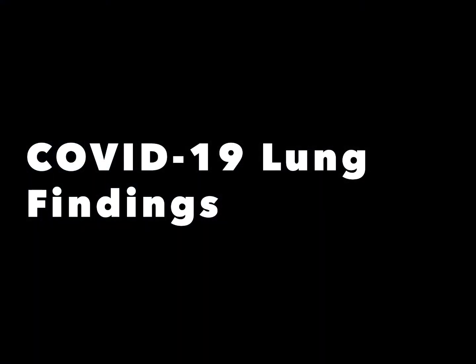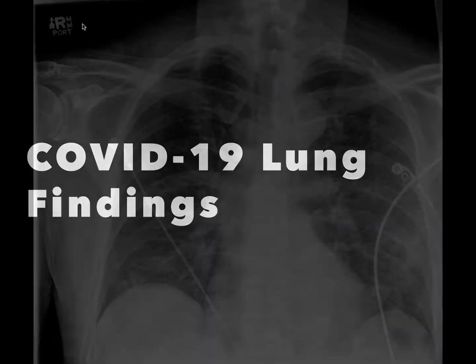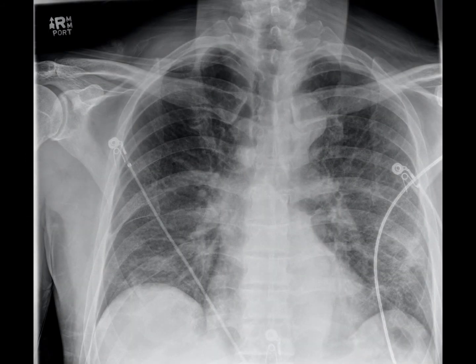Let's move on to our second objective, lung ultrasound findings in COVID. Here are chest x-rays of a couple of patients I've seen recently that needed admission for COVID. They both have an appearance of patchy interstitial infiltrates affecting both lungs.